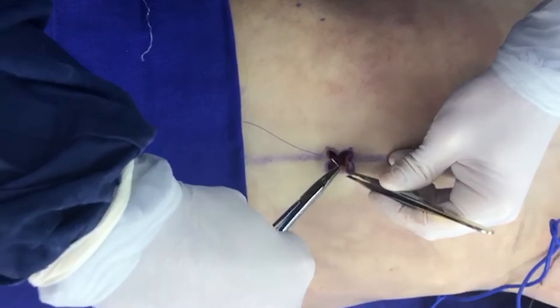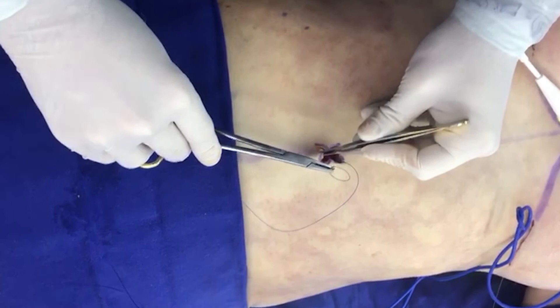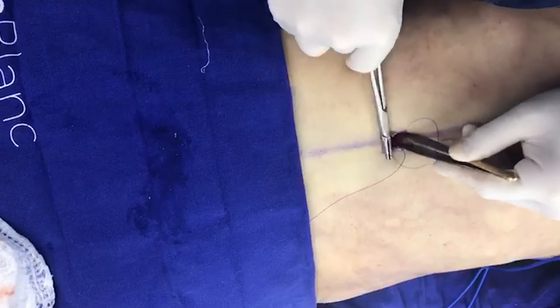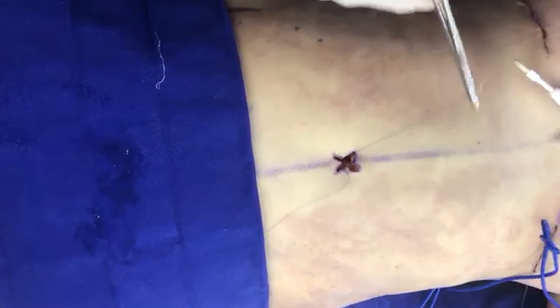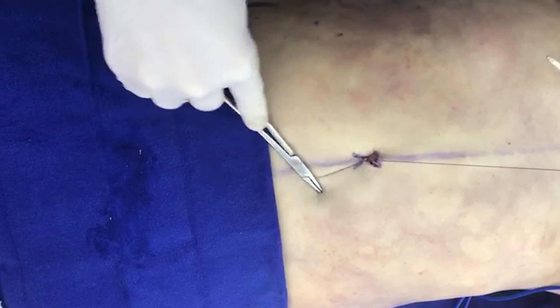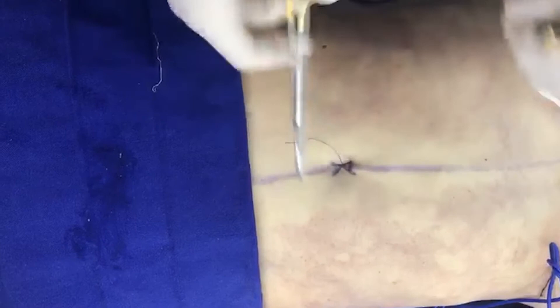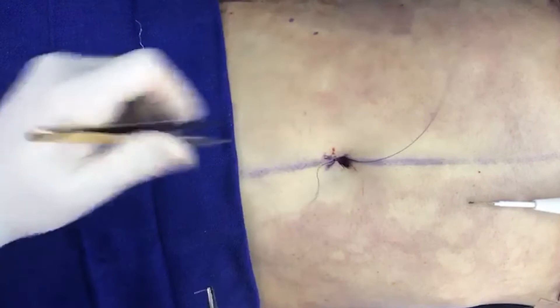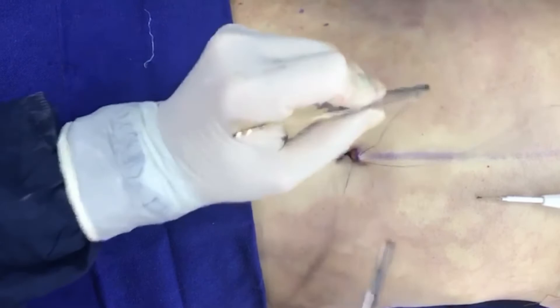We are going to join the left flap, the lower flap, and the right flap all in one suture. We are going to put this into the muscle fascia. So this is the first suture. And now we are going to do the second suture that is joining the upper flap with the abdominal fascia.